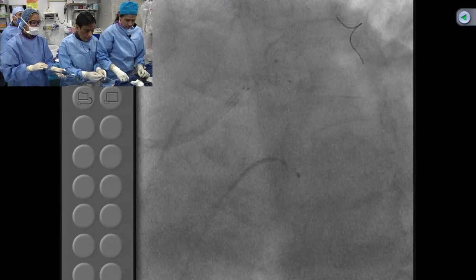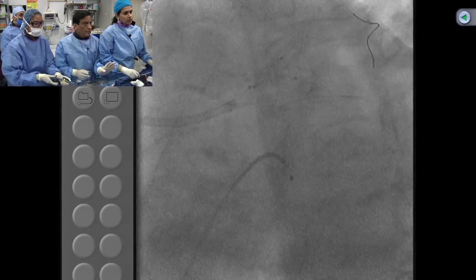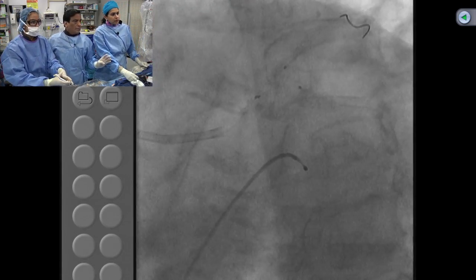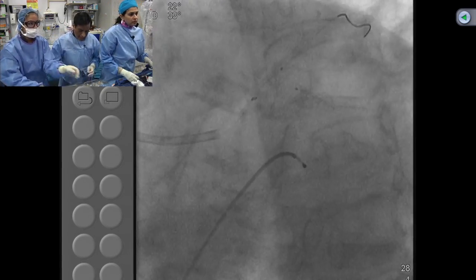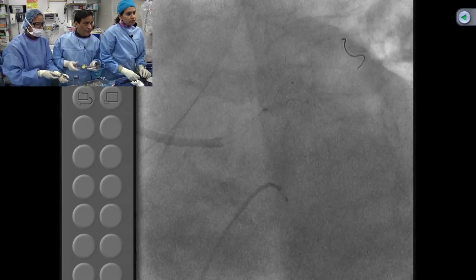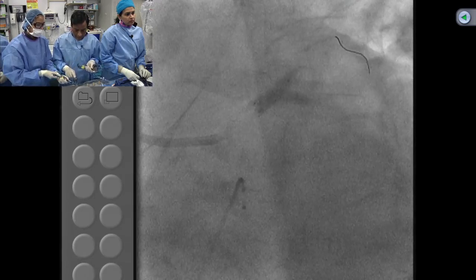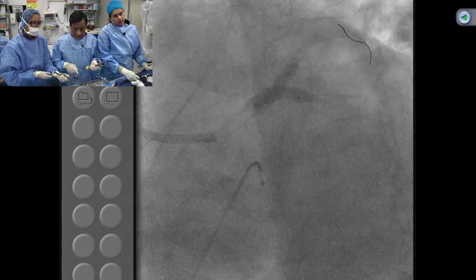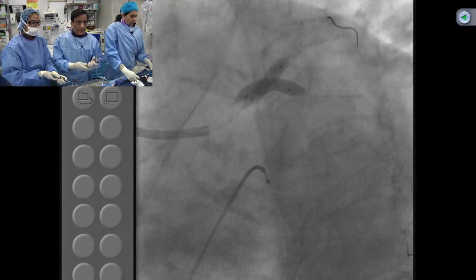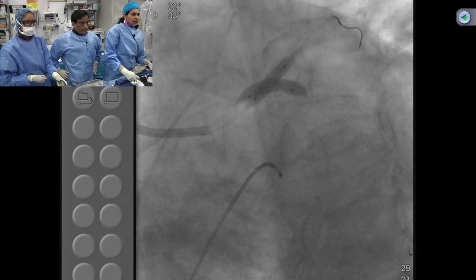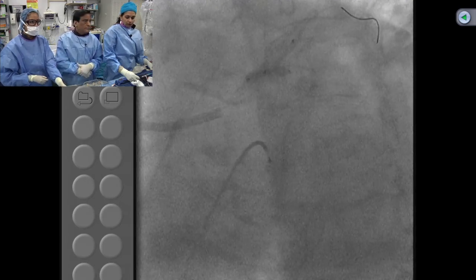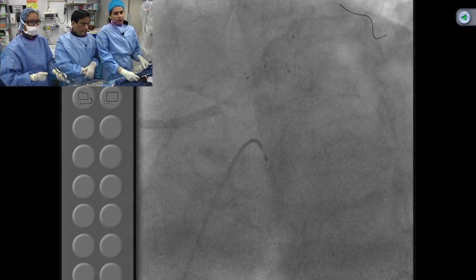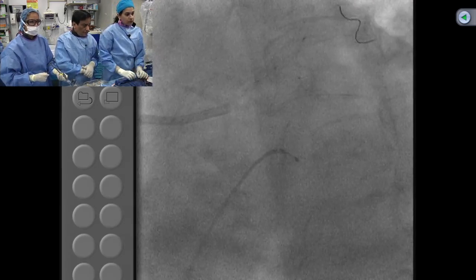Blood pressure has dropped with the kissing inflation. Bring both to the same point. Wait until the blood pressure comes up. This is a wonderful teaching point — we can see the hemodynamics in the corner window. If the pressure does not come up despite neo, you may have to abort the inflation and take out both balloons. Now she is pacing again, meaning pressure has dropped again. Back to normal. Questions are coming in fast and furious. Do you do routine surveillance angiography after left main stenting? In this particular case, no. If there is complex residual disease, then yes — but routine angiography is no longer recommended.